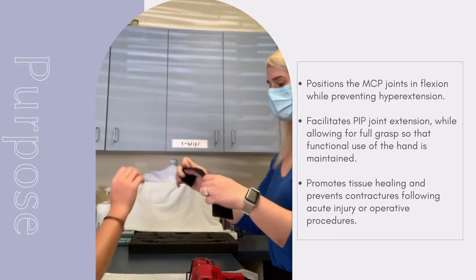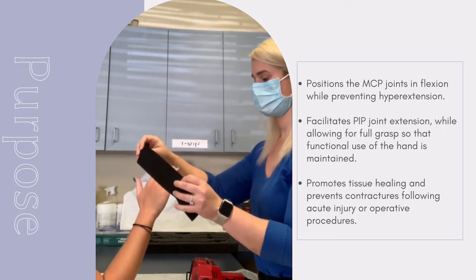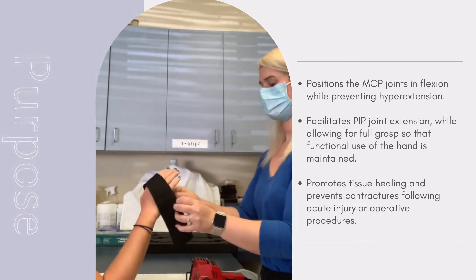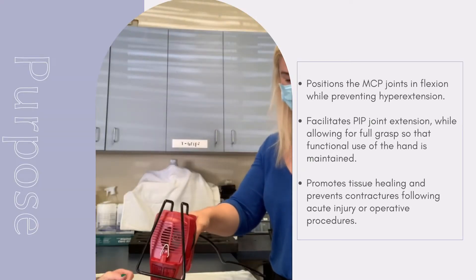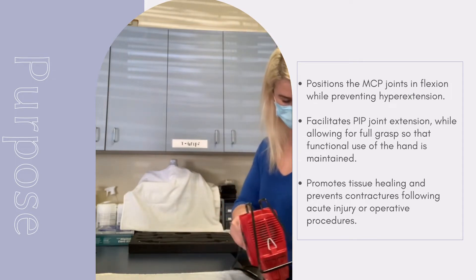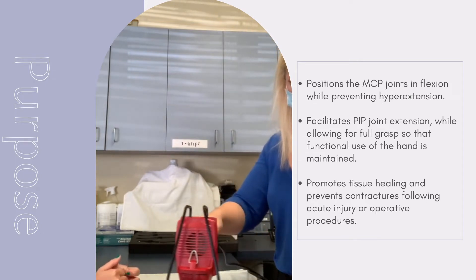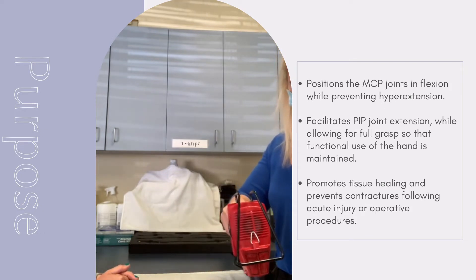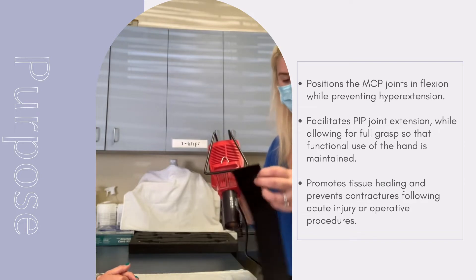The first step is to cut a piece of the thermoplastic that would be long enough to wrap around the patient's hand twice. Here I'm just testing that it's long enough. Next, we need to heat our material by applying the heat gun until the material curls up in one direction, and then we flip it over and heat the opposite side.